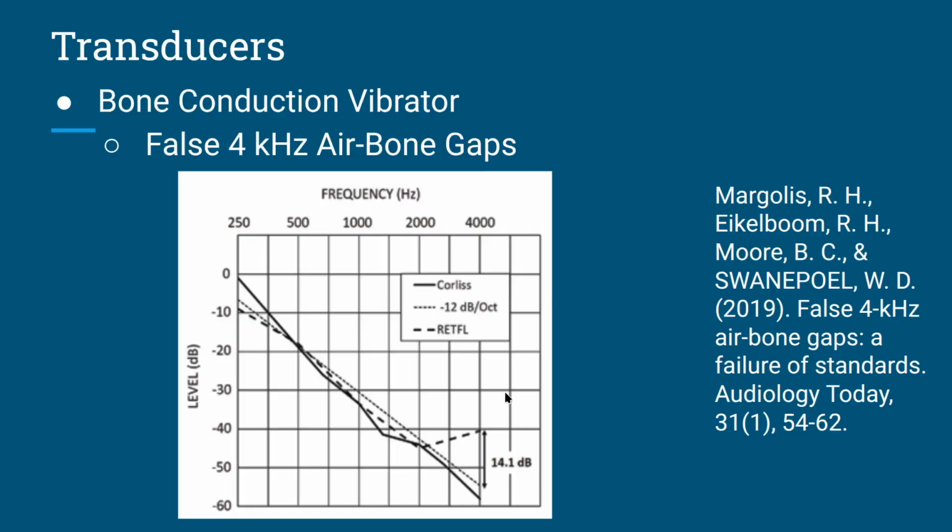So what to do? First, the diagnostic impact. Reporting these false gaps without correction risks misinterpreting the loss as conductive, leading to unnecessary medical referrals, imaging, or surgery.